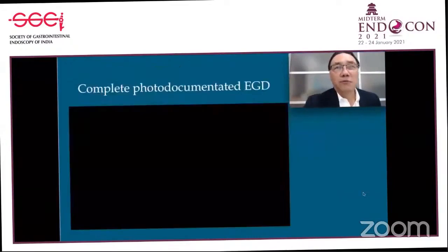I think that complete photodocumented EGD is feasible, but needs training. My personal opinion is that photodocumented EGD is a quantifiable EGD parameter that can be used as a quality indicator. Just let me show you a video.